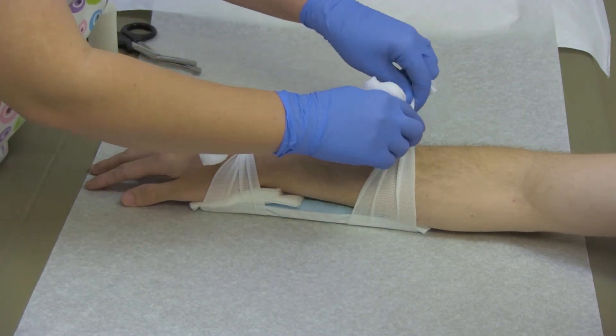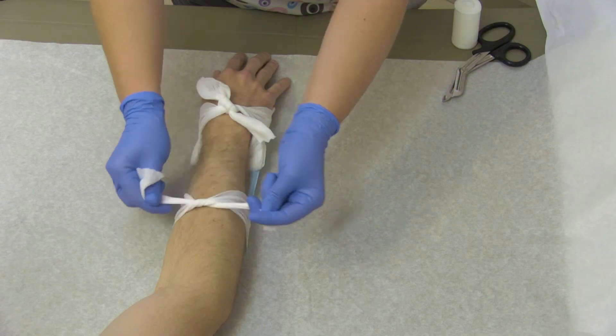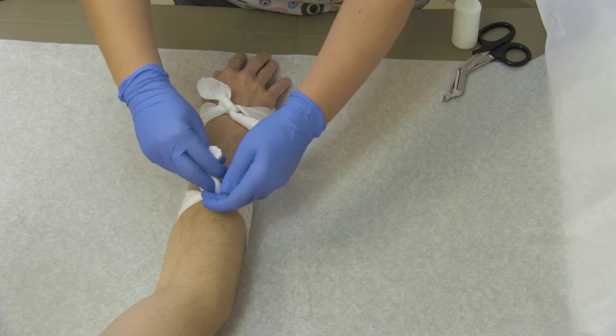After splinting, be sure to check the hand and the arm color for circulation, noting the color of the nails and checking the pulse. Loosen the splint if it's too tight.